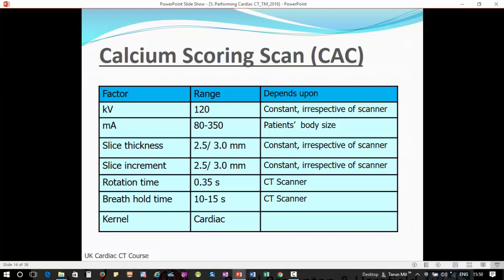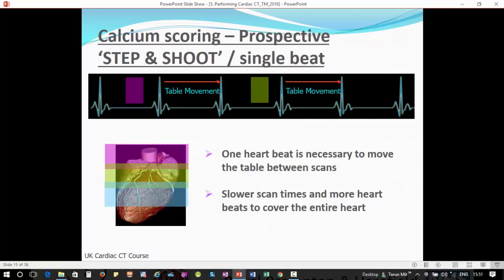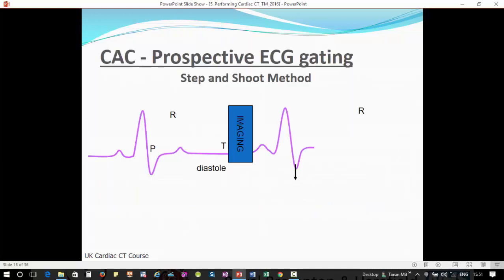So the calcium scoring scan actually takes longer than the angiogram in most cases because it's prospective, it's step and shoot. So actually if they can hold their breath for the calcium scoring part of the scan, they'll easily hold their breath for the angiogram. So it's step and shoot: take a scan, the table moves, scan again, table moves. So every other heartbeat we're scanning. And we're imaging primarily through mid-diastole, roughly 70 to 75% of the cycle.